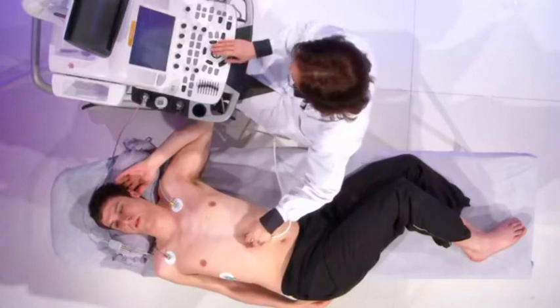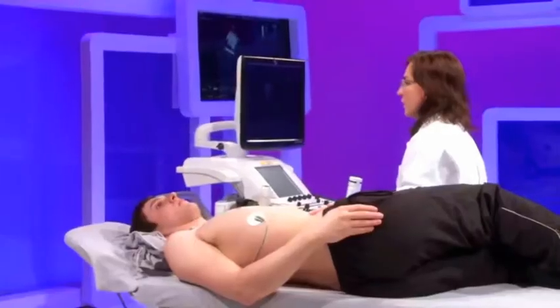So after this overall examination, I would conclude that the mechanism in this case of the tricuspid regurgitation is a functional one, and there are no criteria of severity, so we can conclude for a moderate tricuspid regurgitation. Again, this conclusion does not come from a single number, but from integrating information by morphology, Doppler, and continuous wave Doppler, and also related to the size and the response of the inferior vena cava.